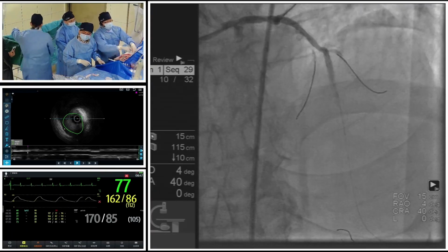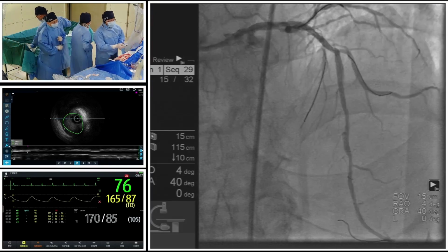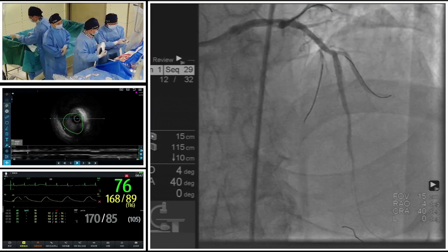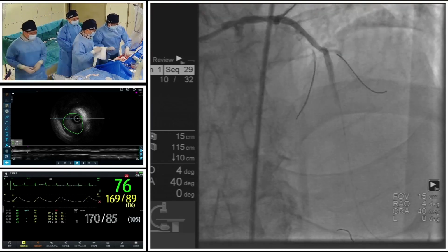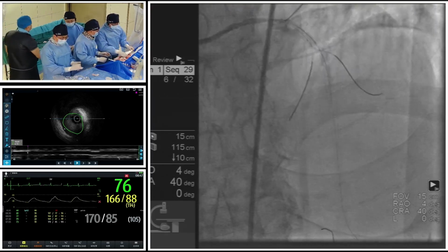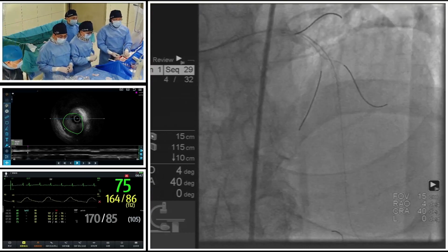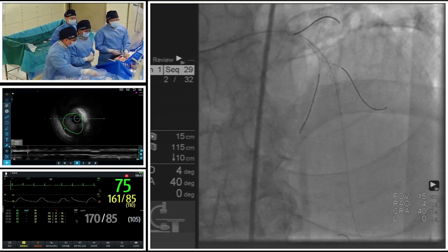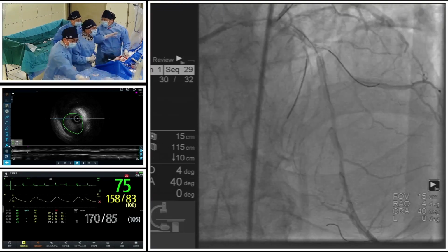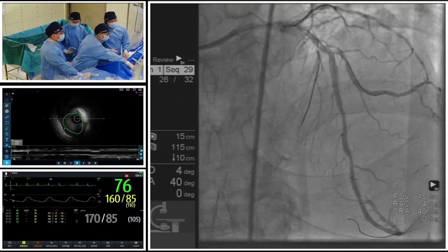After the rotablation, we use the IVUS to detect some very deep and very thick calcification, especially at the left main trunk and the proximal diagonal. So we chose the IVL as a second strategy to treat all these big calcifications. You can imagine that when we use big balloons to do the sequential dilation, both the septal branch and the diagonal are maintained.